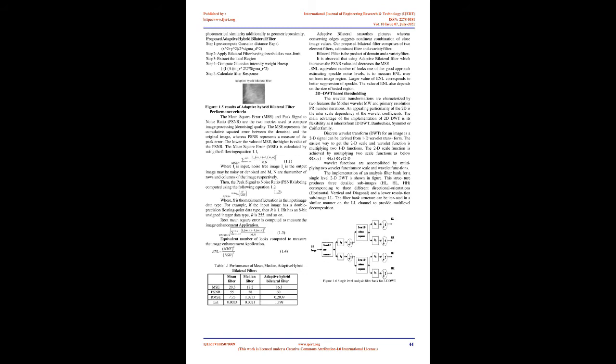Calculating features of image. It is a challenging process for researchers to eliminate noise from the noisy image to get the original image because it introduces artifacts, blurring, ringing effect, staircase effect and checkerboard effect in the images. It is very important to identify the noise present in the image to select the appropriate denoising algorithm. If the image is corrupted with salt and pepper noise, the filtering methods perform better. The wavelet-based approach is useful if the image is corrupted with Gaussian noise. So the denoising algorithm is application dependent.